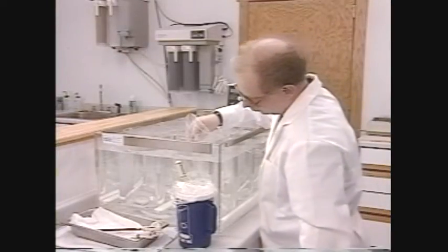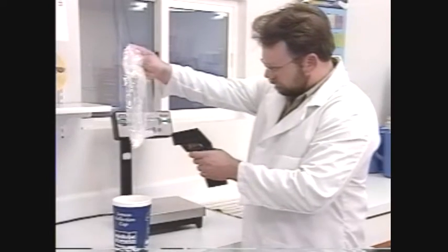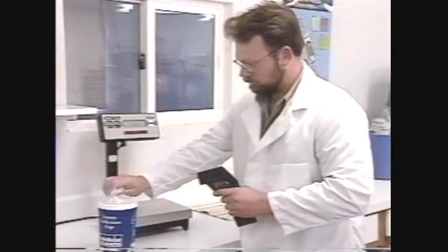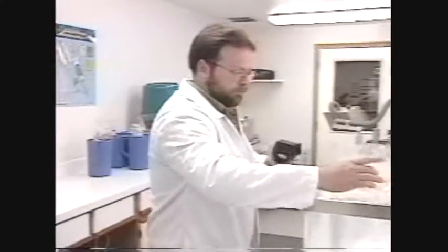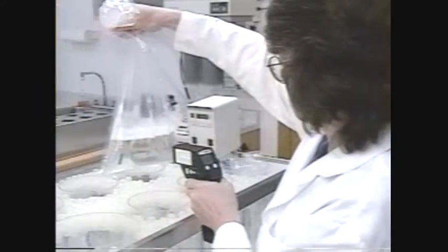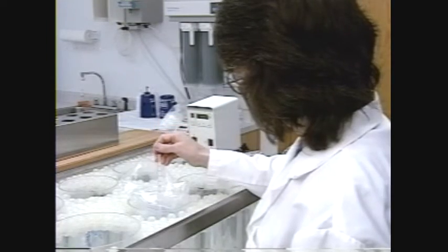It is imperative that the extender and semen be at the same temperature when mixed, and that the extender be added slowly to the semen. Adding extender that is more than 1 degree Celsius different than the semen may cause temperature shock, which could reduce fertility. Digital, infrared, or mercury thermometers can be used to verify temperatures.